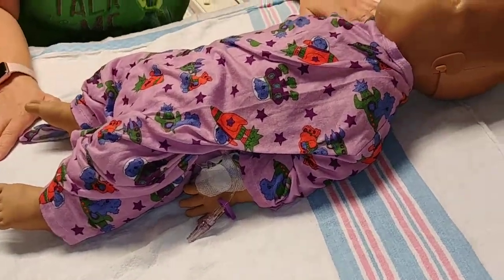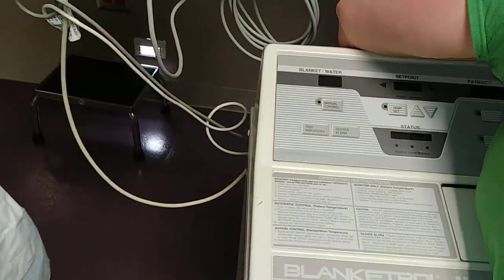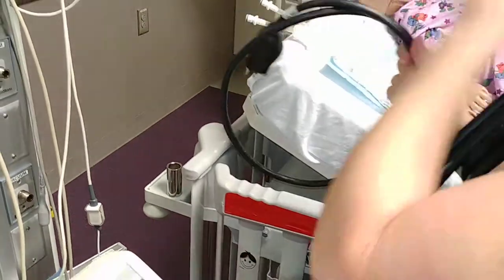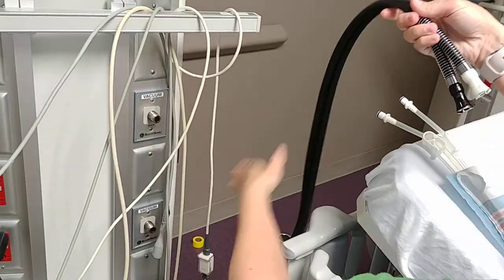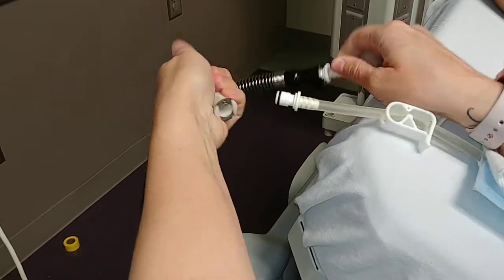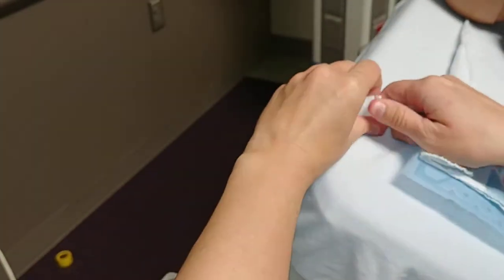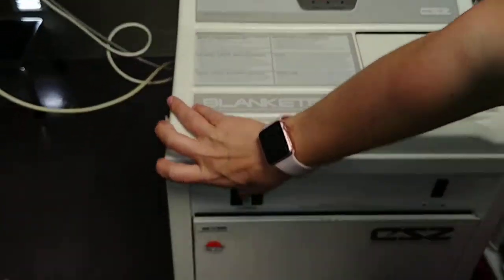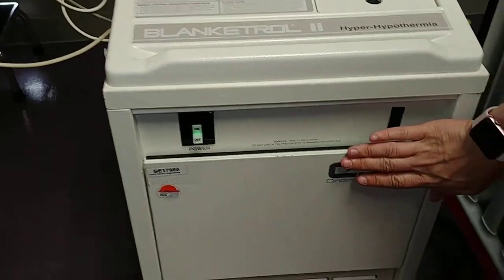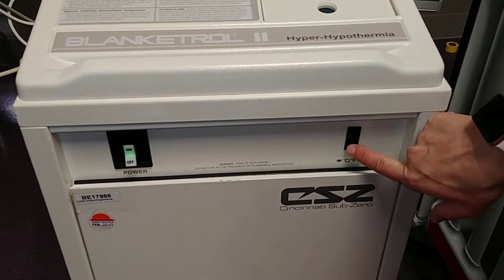Next, once the blanket is underneath the patient, go ahead and hook it up to the machine. Plug the machine in, then hook up the hose from the Blanket Troll to the hose on the blanket. Once hooked up, un-clamp the clamps on the tubes, and then turn on the machine. The power button is on the front panel. There is also a switch to change from Celsius to Fahrenheit — we use Celsius, so the switch will be down.